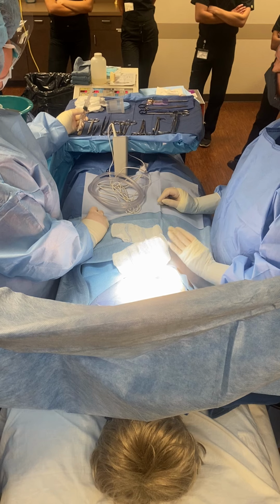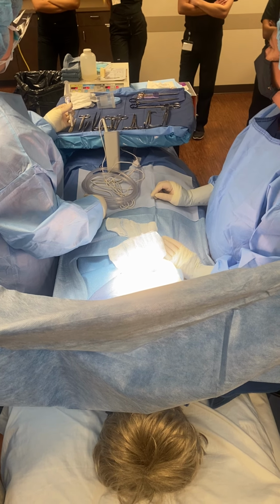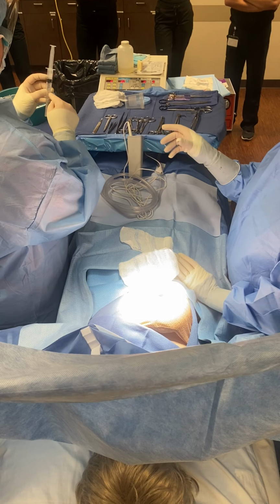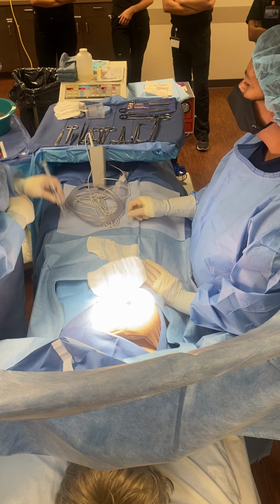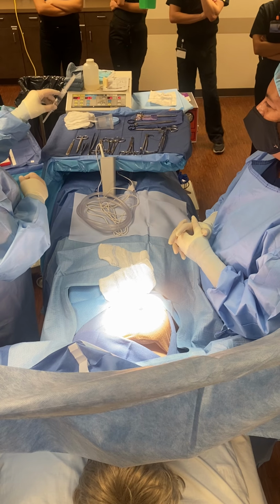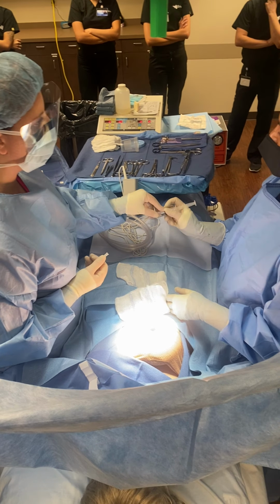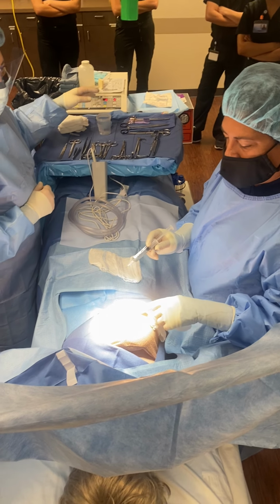Agreed. Okay, so when we pass the local, we want to tell them what it is, what the strength is, what the expiration date is, all that fun stuff. And you want to pass it like the scalpel, all right? You got to be closer to the business end. Okay, they're going to receive it like this. But if you give it to them like this, they're going to be like, right? So you got to remove the cap, same way. Hold it how you're going to pass it. Just turn your hand upside down. Keep your elbow in. Pull your cap away. And then you're ready to pass. This is 2% lidocaine with epi, expires 8/21. There's only 8 mLs in there. Thank you. Okay.